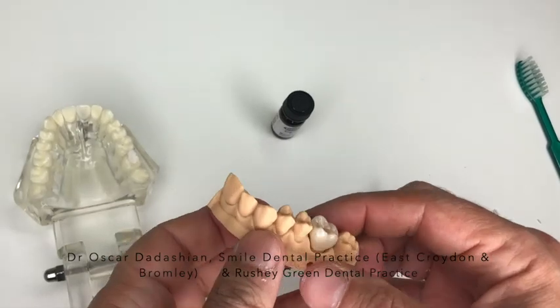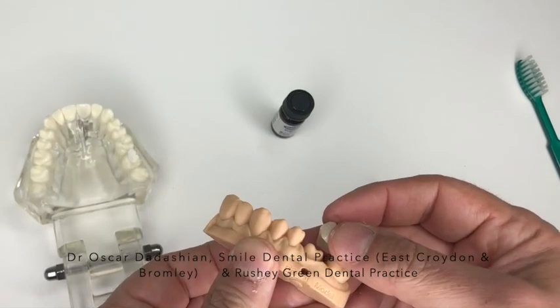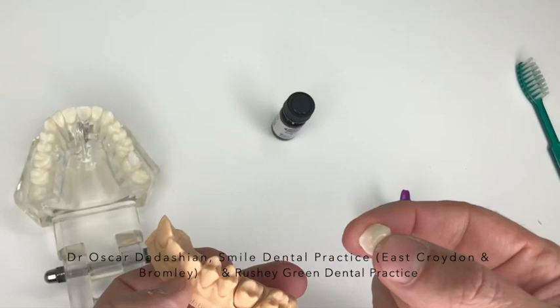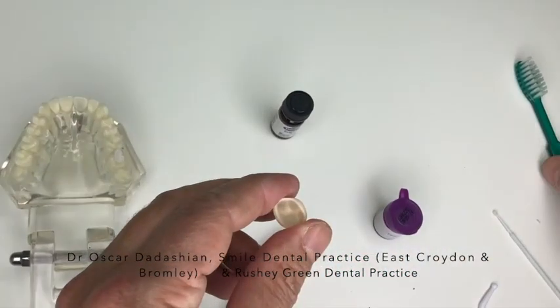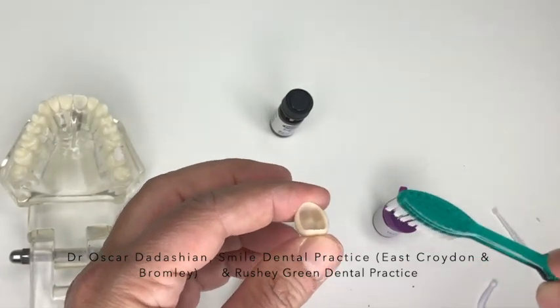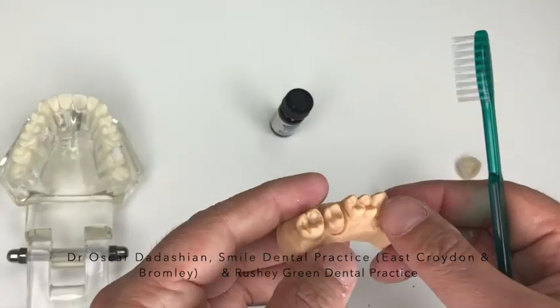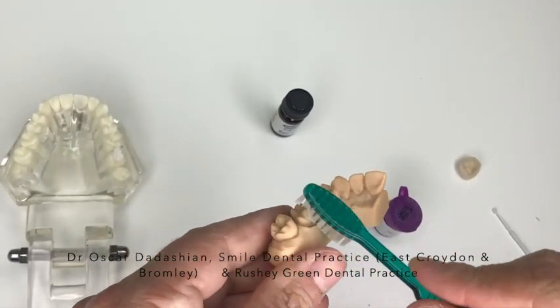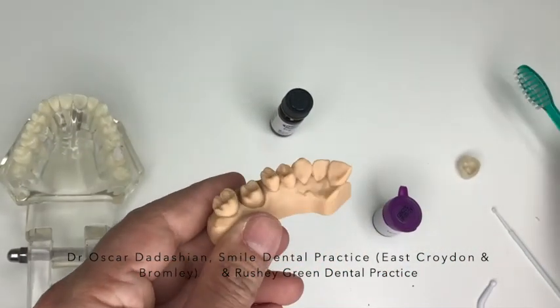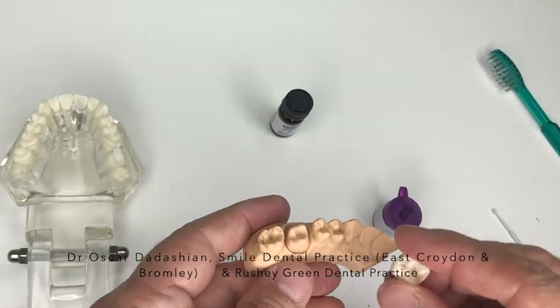Right, you can also use this kit to cement a crown in. So let's say you have a crown that has come out and you want to put it back in temporarily. First of all, you take your toothbrush and clean this very gently all the way inside. Make sure all the debris and remaining food comes out and it's nice and clean. Take your toothbrush and very gently clean the tooth too. Obviously the tooth is going to feel a bit sensitive, that's perfectly fine. Just do it nice and gently.